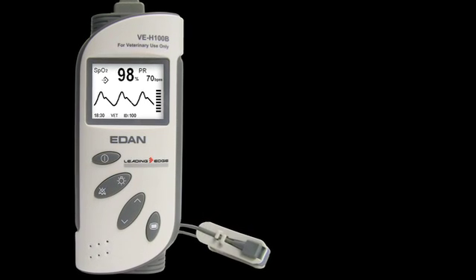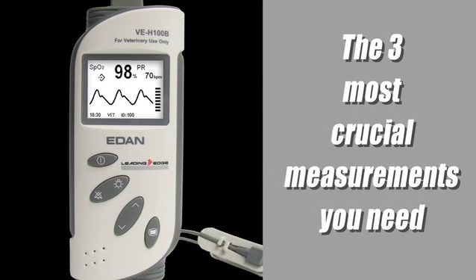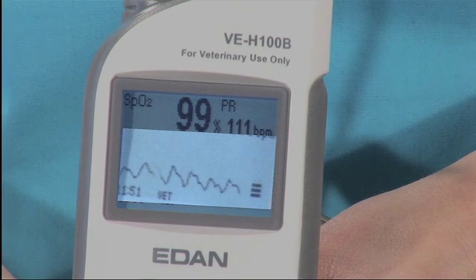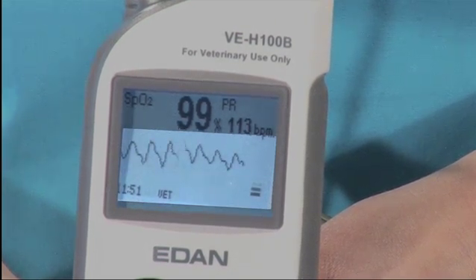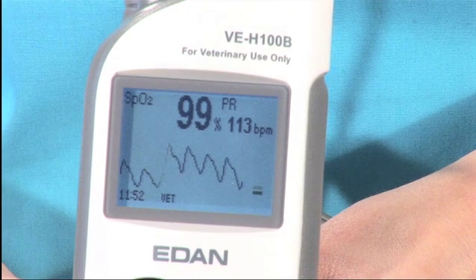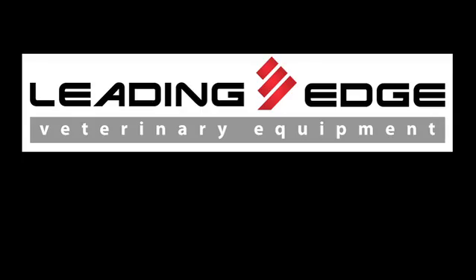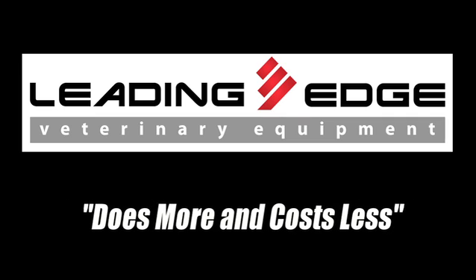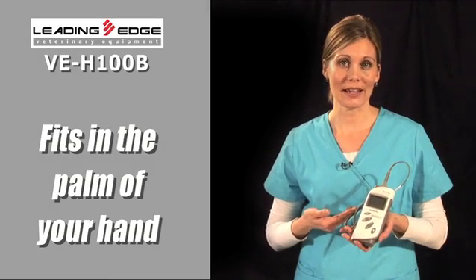What would it be like to get your hands on a pulse oximeter that has the three most crucial measurements you need right on the easy-to-read LCD display, including plethysmographic waveform, all at a cost that would surprise you? Introducing the VE-H100B from Leading Edge Veterinary Equipment — it does more and costs less, and still easily fits in the palm of your hand.